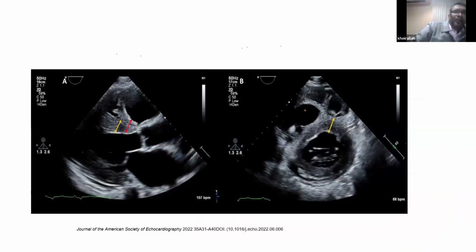Good. Now for the septal measurement, of course it's important also as part of LV quantification is the thickness of the muscle. So we look in here, we see the thickness, LV thickness. Do we check this thickness in systole or in diastole?